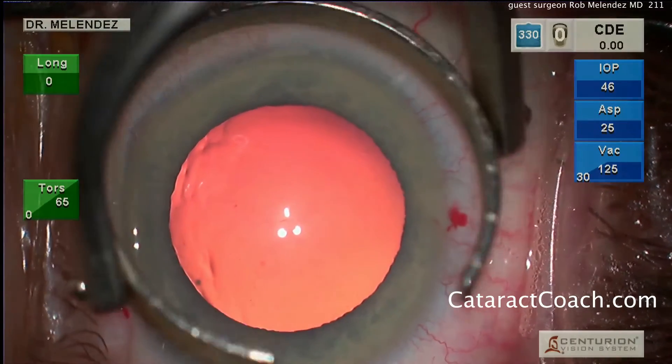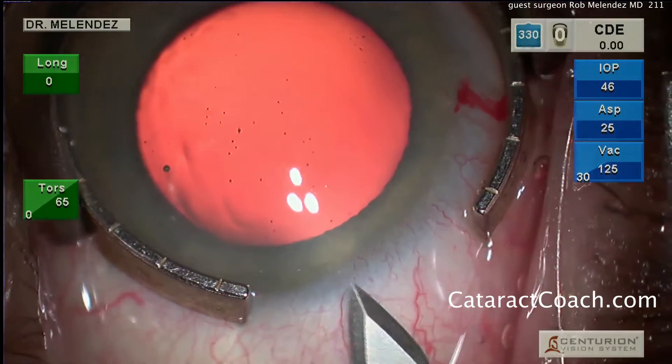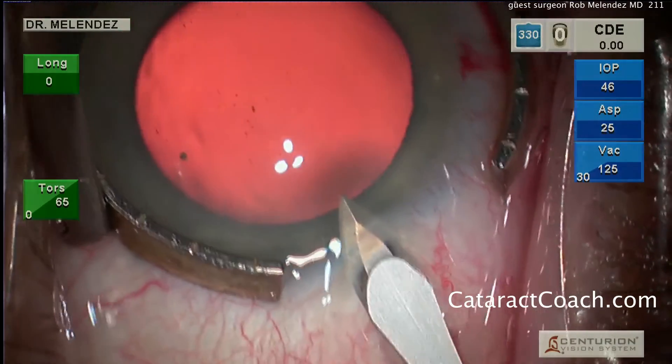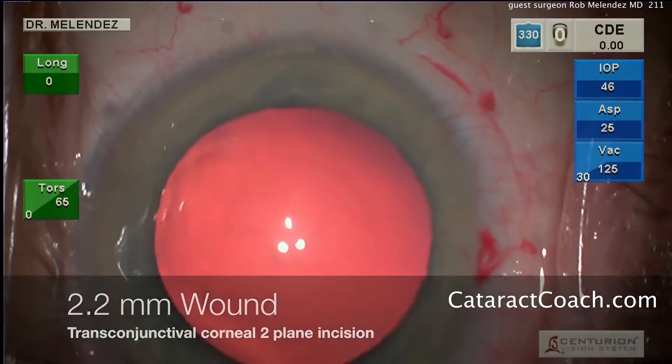Now he's going to put a fixation ring on the eye and create his main incision. He's sitting temporally, so it's a temporal incision. What's a little different here is he does it at or slightly posterior to the limbus — a nice long transconjunctival, two-plane incision.